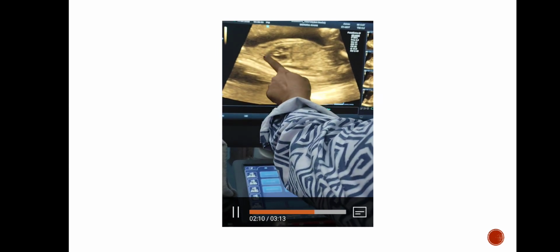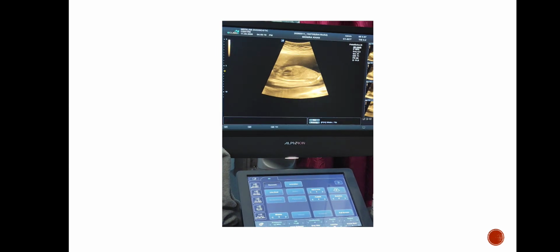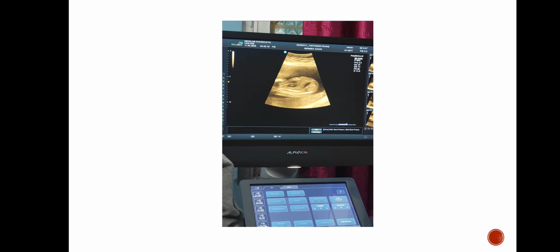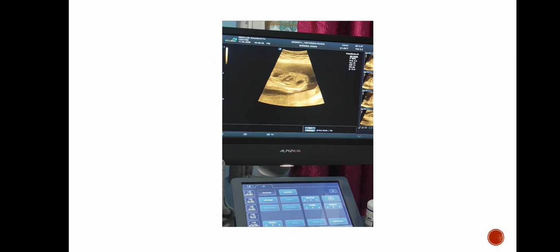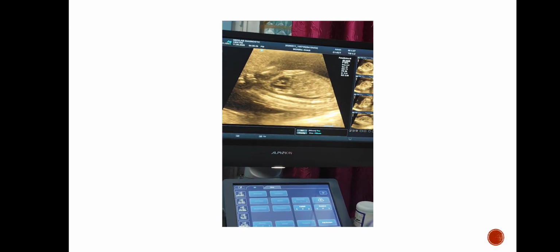See the arch, ductal arch. This is ductal arch. No neck vessel seen, so this is ductal arch. Aortic arch. Neck vessels are originating. This is aortic arch.